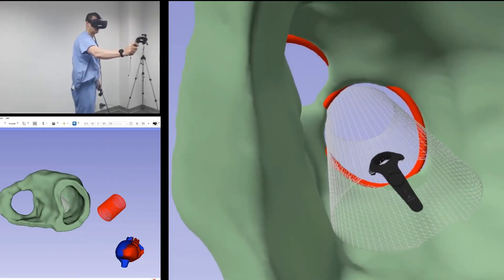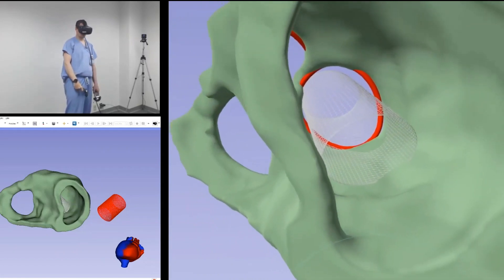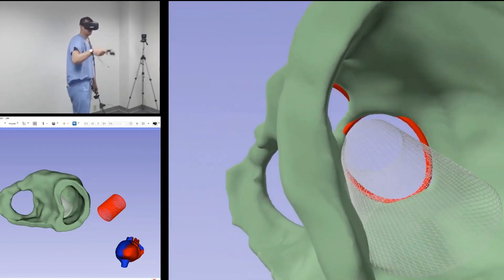We then angle the device towards the posterior medial papillary muscle and note the increased area in LVOT.